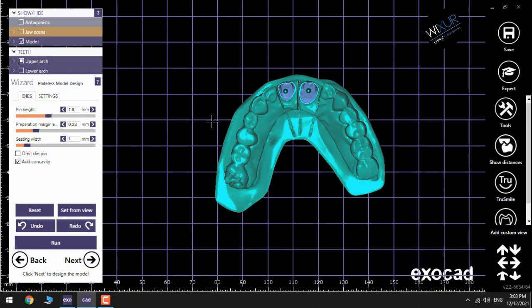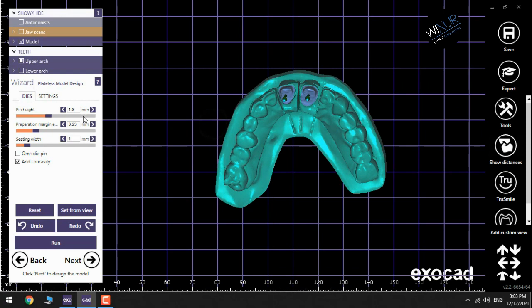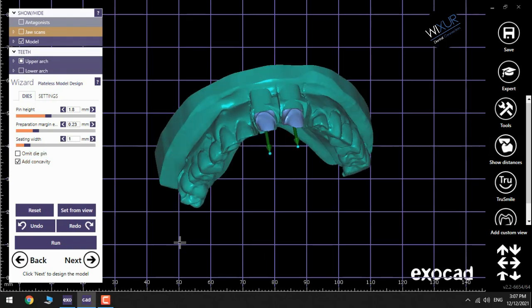Pin height, preparation margin, seating width—I use all of them as default. Next.